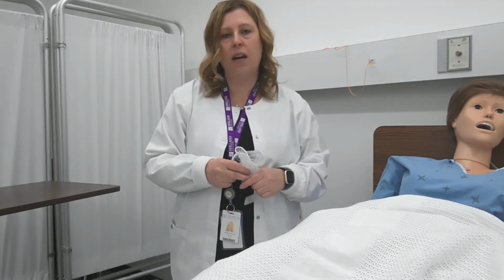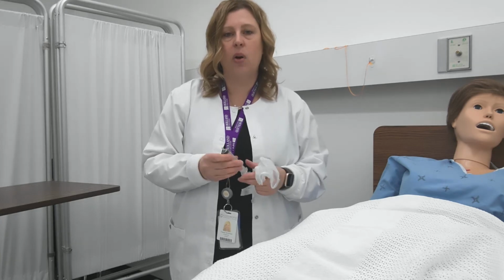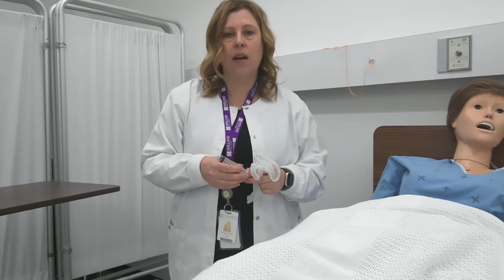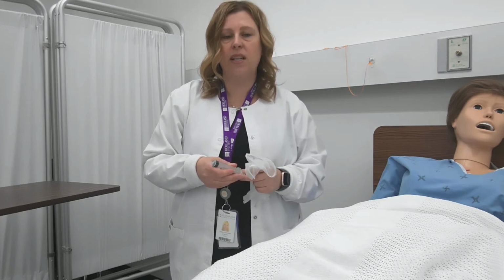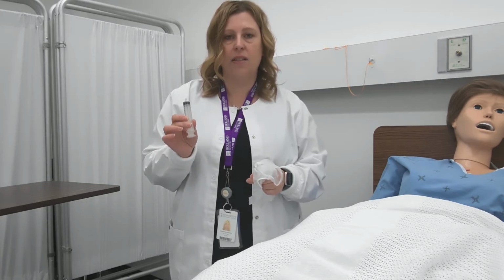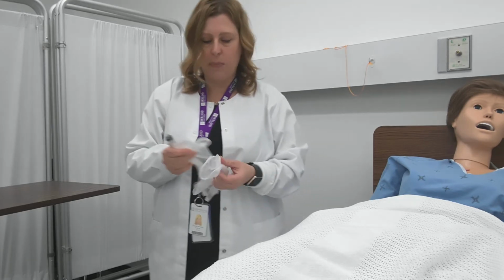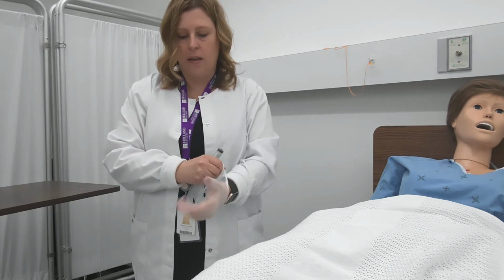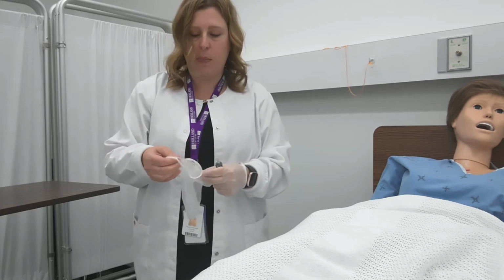I want to check my care plan to see what size bulb was used to inflate the catheter. In this instance, my care plan indicated that my client had a 12 French Foley with a 10 cc bulb. I'm going to make sure that I have a 10 cc syringe with me. I'm going to put on my procedure gloves, and I'm going to explain to my client what I'm about to do.